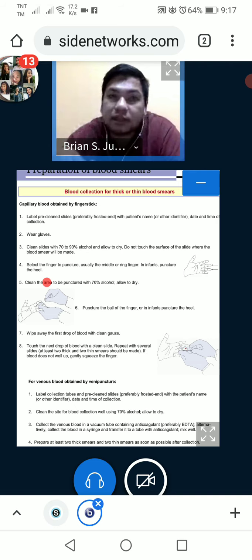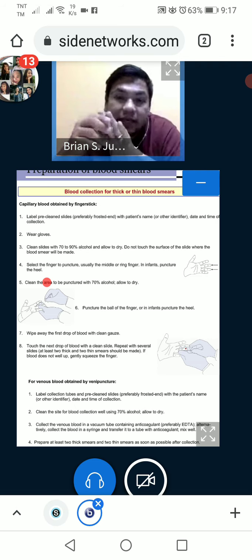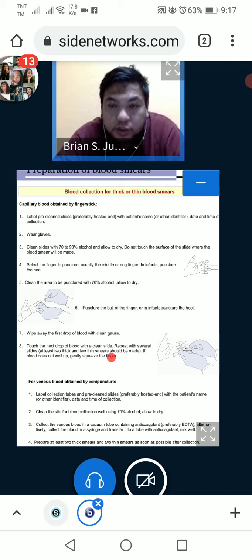Okay? Sir, bakit, sabi mo pinakamalaki, bakit hindi thumb? Sobrang laki naman ni thumb class at saka sobrang kapal din ng balat sa thumb. So baka pag prick mo, walang lumabas na dugo kasi makapal. So mamimili ka lang dito sa dalawa. Yung dalawang middle fingers. Okay? So puncture, usually class, sa gitna.